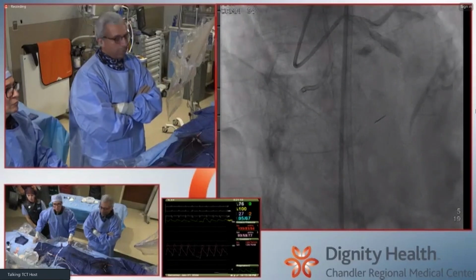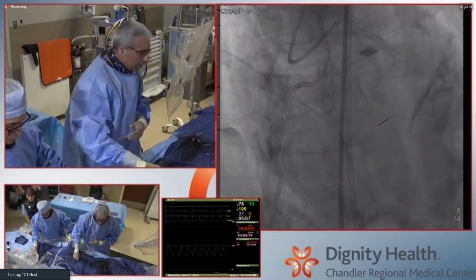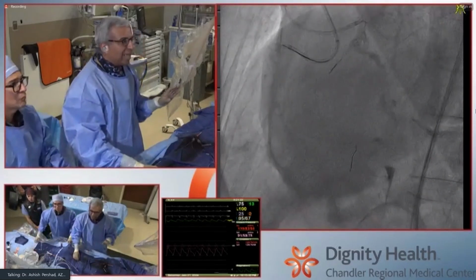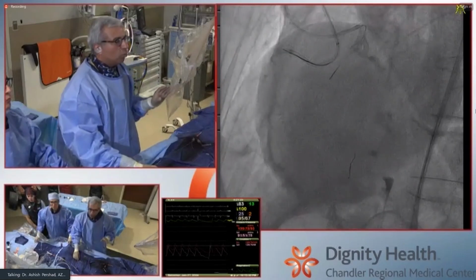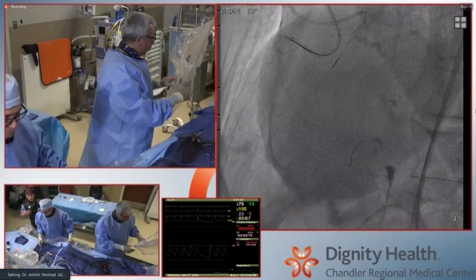Dr. Kaiser Nasrullah? Yeah. What are your thoughts about retrograde versus antegrade, and are you going to approach this with proximal septal through? So Sanjo, before you get everybody going, can I just work and talk at the same time so we're not eating up time? So please do. I'll tell you what we've done so far.